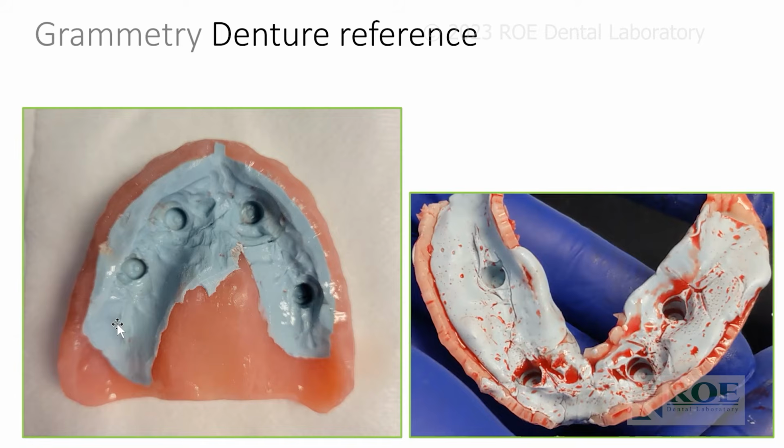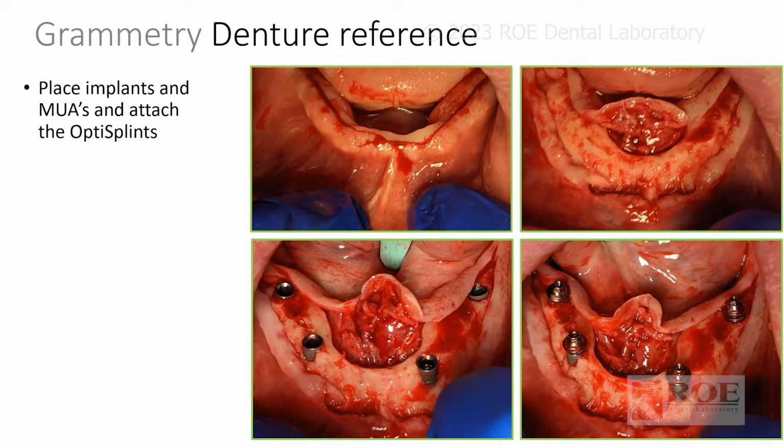A lot of doctors are very good at taking bites with an immediate denture loaded with blue mousse material, some kind of PVS, and that will pick up the healing collars, right? So then we have the healing collars, the denture, the teeth, the tissue. We have everything we need for a virtual articulation, a real articulation after surgery. Let's just go through this one really quickly.